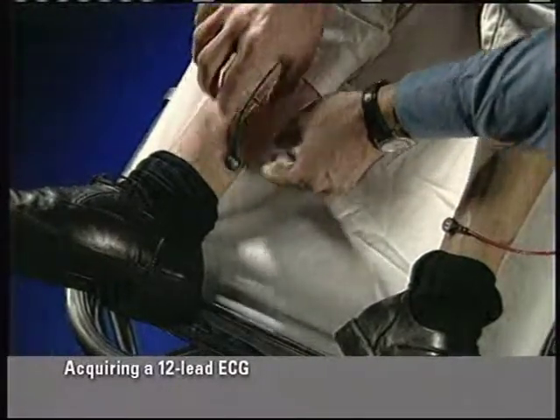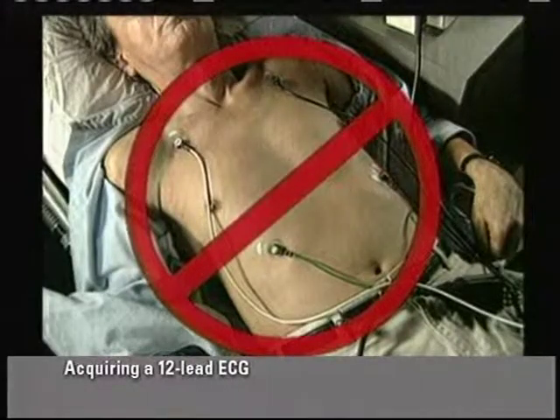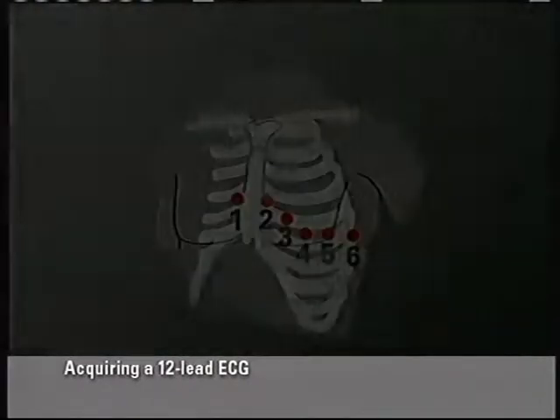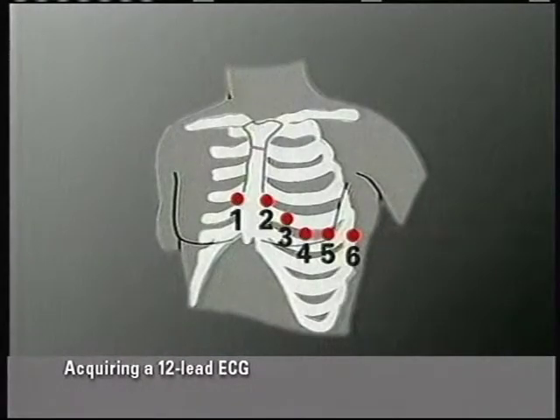Although they can be placed anywhere along the limbs, do not place the limb lead electrodes on the torso when acquiring a 12-lead ECG. Next, place the precordial leads 1 through 6 on the chest. Accurate placement of these leads is critically important. Practice finding the landmarks on yourself and others.